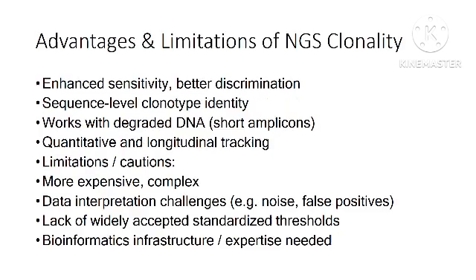So advantages we have seen. Limitations are also there with NGS: it is expensive, complex, you need expertise, and you may have data interpretation challenges with FFPE samples specifically, and a lack of widely accepted standardized protocols and thresholds. So you also need bioinformatics infrastructure and expertise.